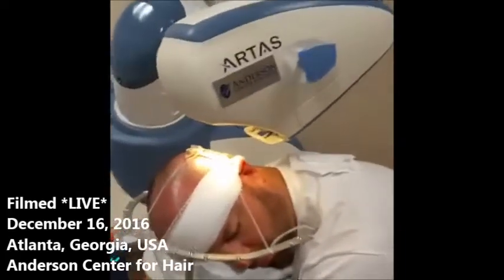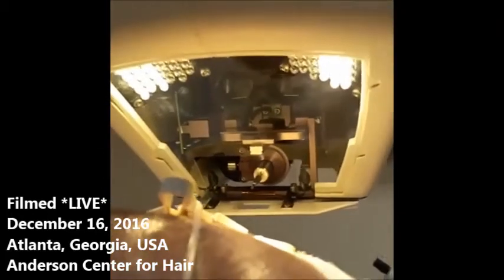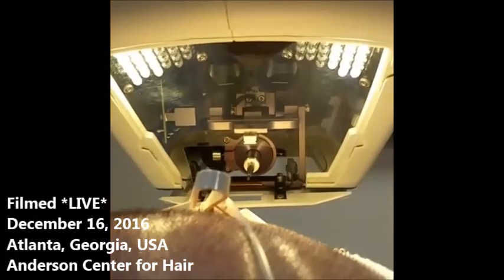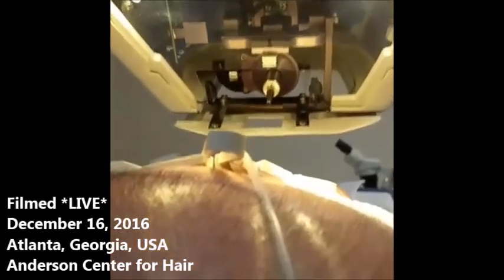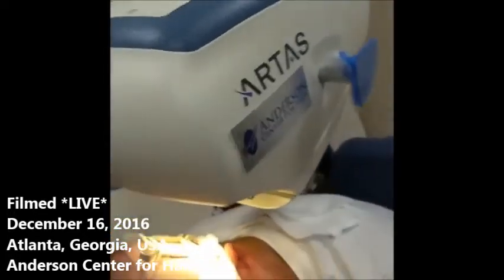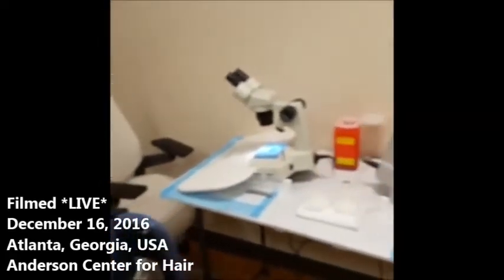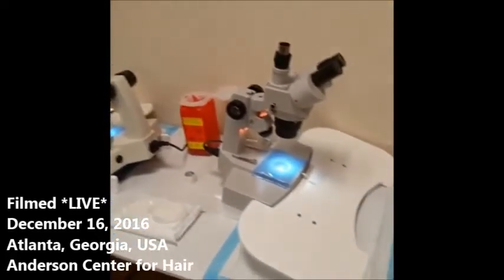We're going to show the viewers the business end of the robot. What we're looking at are the two stereoscopic cameras at the top of the screen — they're kind of looking at you like eyes. The white LED lights are there to illuminate the surgical field, and then we have the surgical punch ready to go. In terms of what else we have here, we've got the microscopic dissection stations, where we count, sort, and trim all of the follicles.